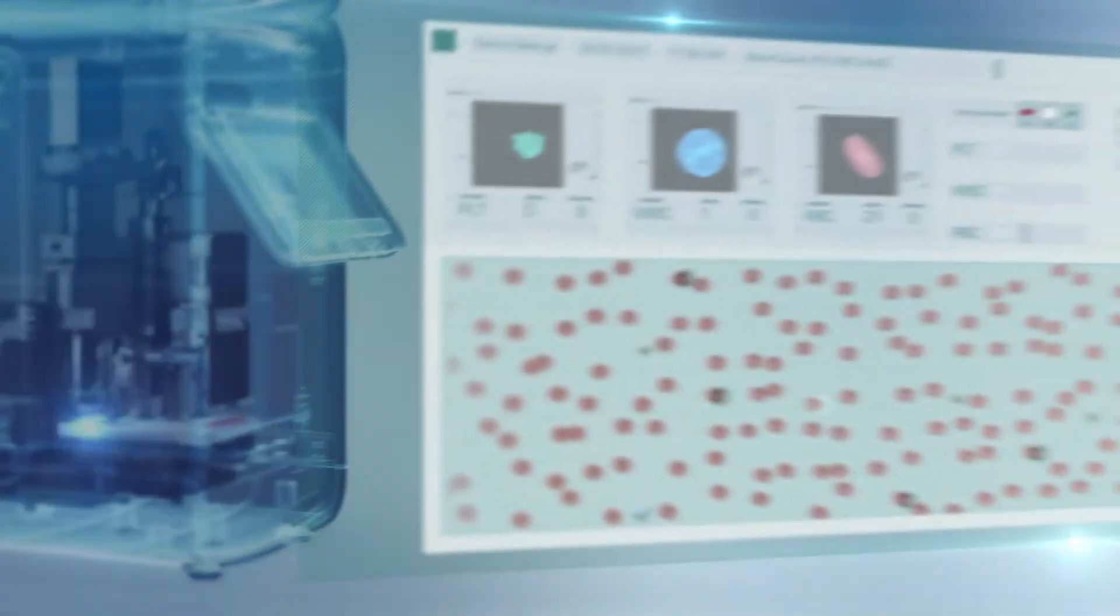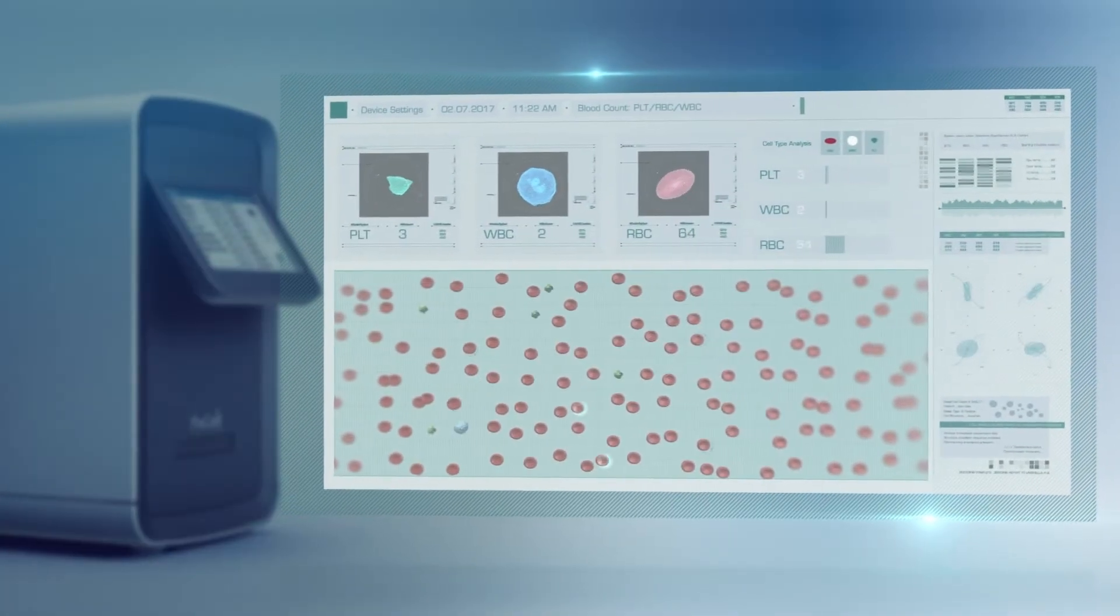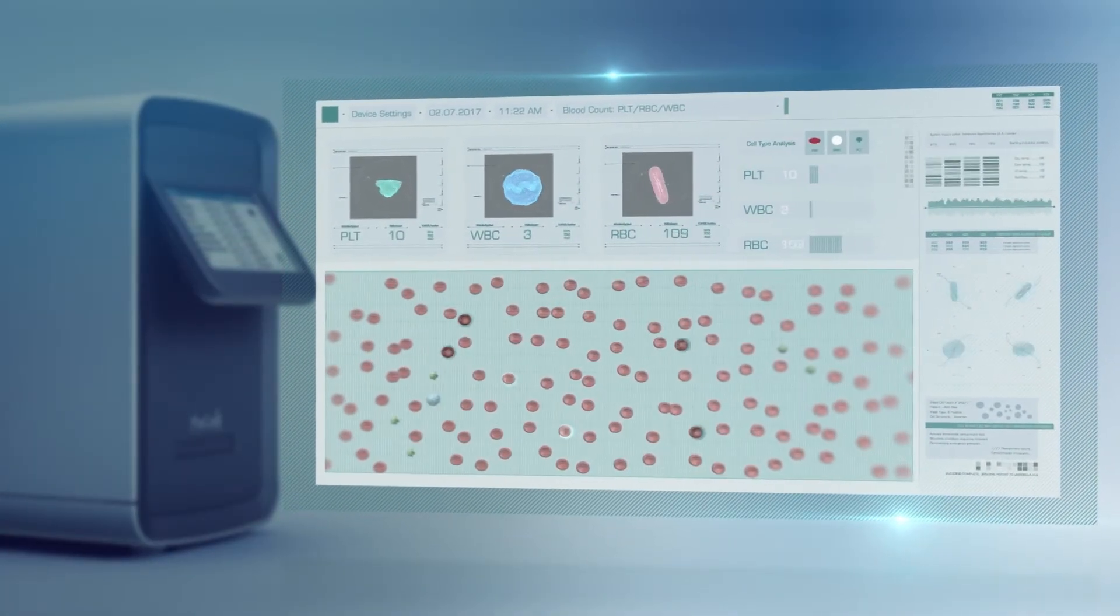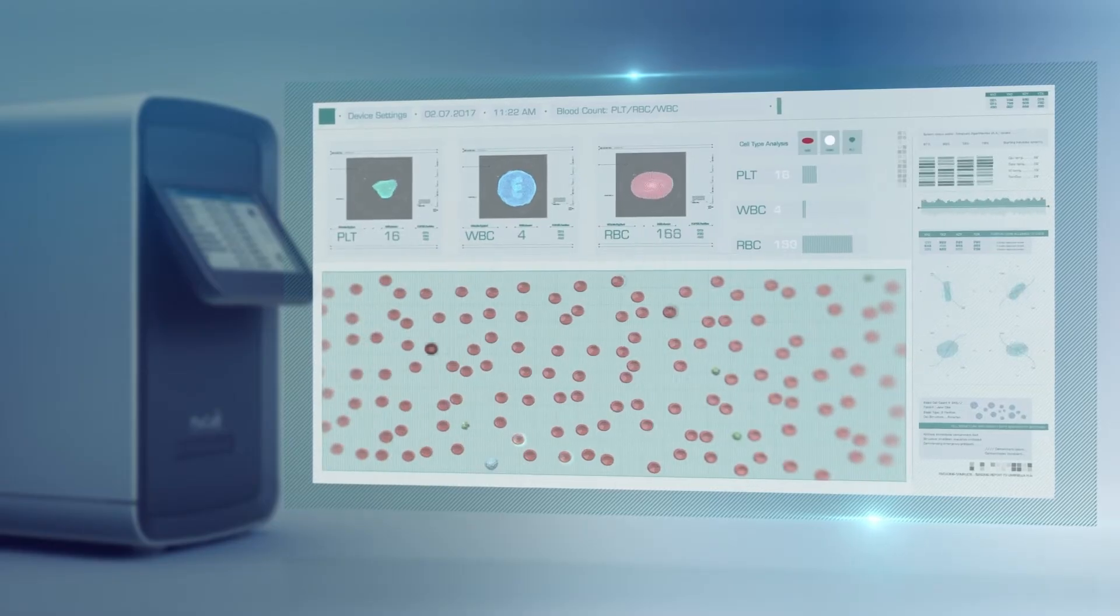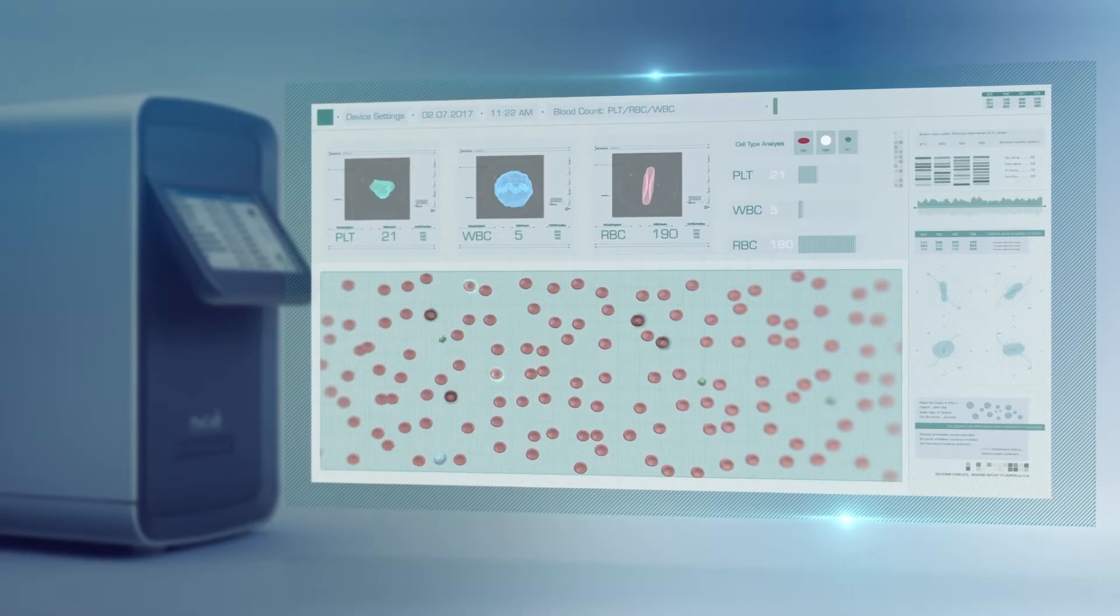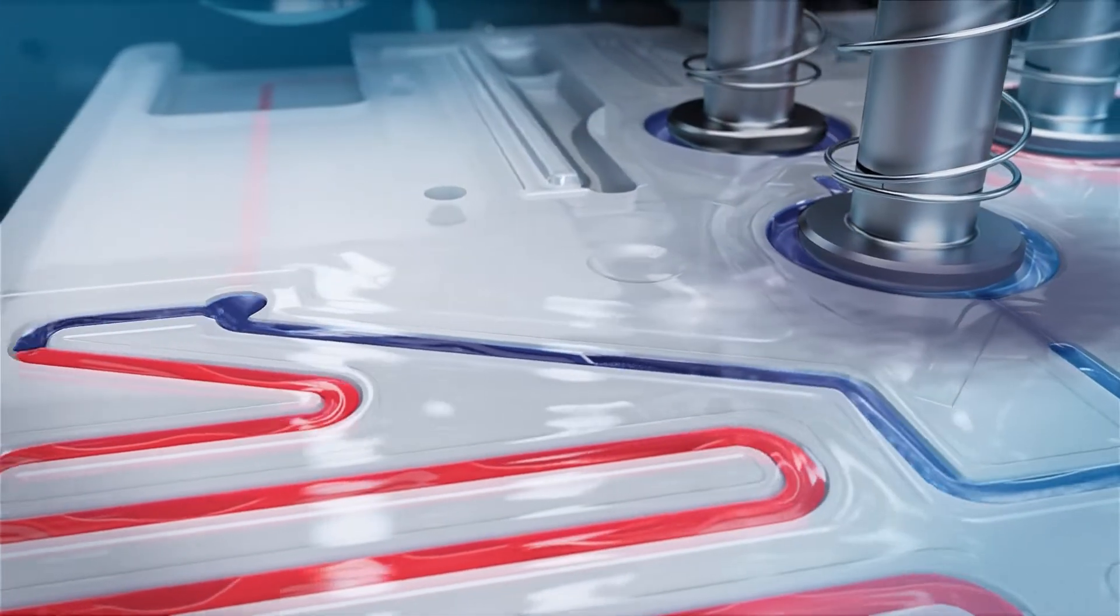Initially, the system counts the red blood cells, white blood cells, and platelets based on the cell shape, size, and color. At a later stage, white blood cells undergo five-part differential classification.